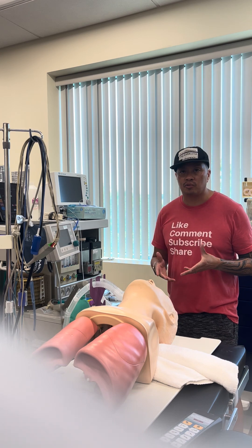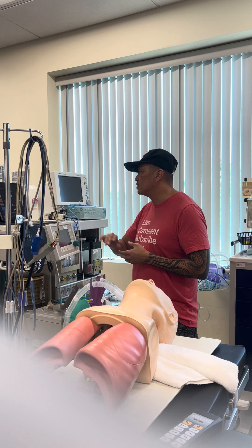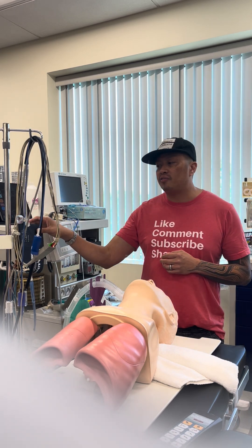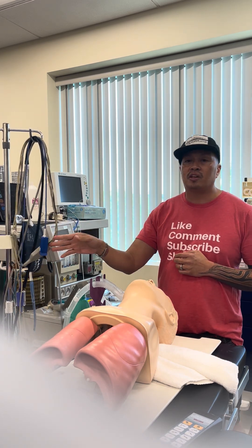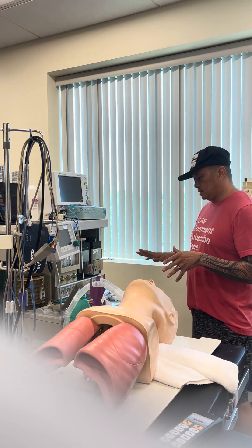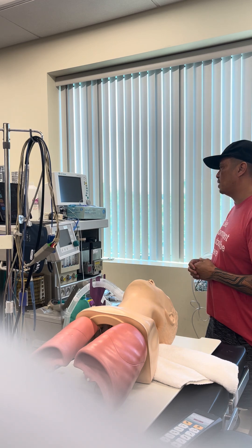I also have my ETCO2 within 35-45, my blood pressure and my heart rate are within range — into 100, 60-100. And I have a thermometer just in case I need it. I do have my blood pressure cuff, I have my EKG leads and my EKG stickies, as well as my SPO2 finger monitor. And I set the scope as well.